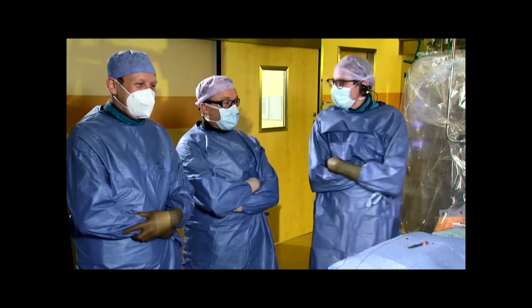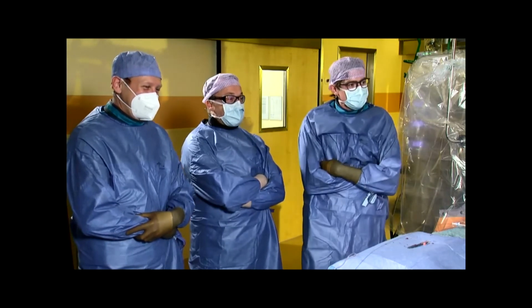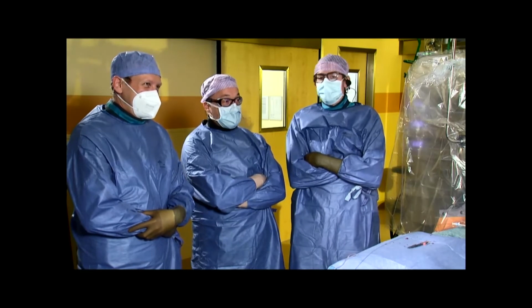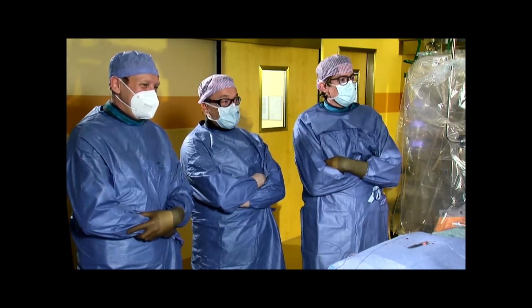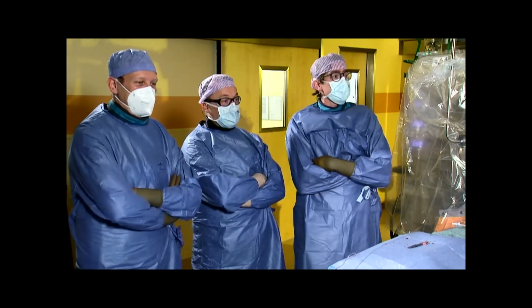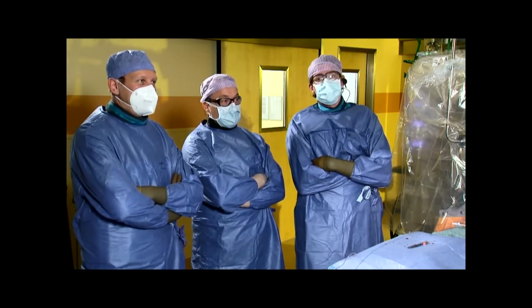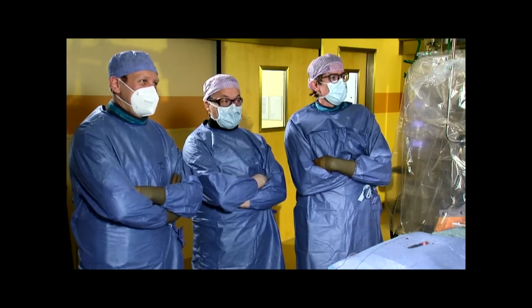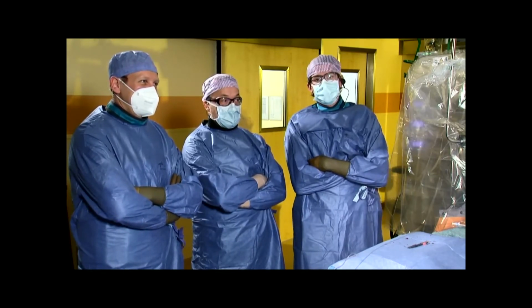It's a perfect day to have you on board and to support us with your experience. Without further ado, I'm going to hand over to another very important person for the procedure, Professor Ender. He will guide us through the procedure by performing the TEE, and we're going to jump right into the anatomical and morphological details of that case.